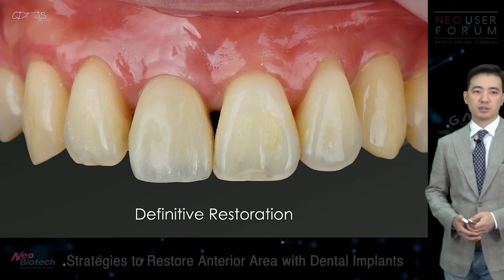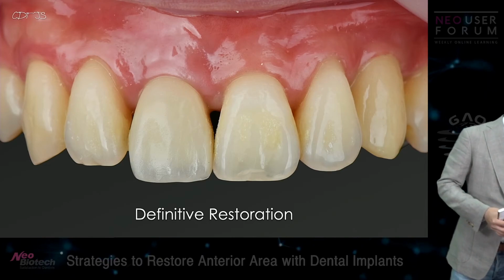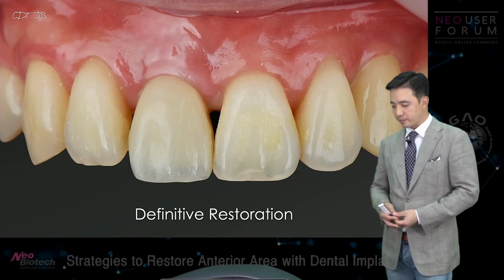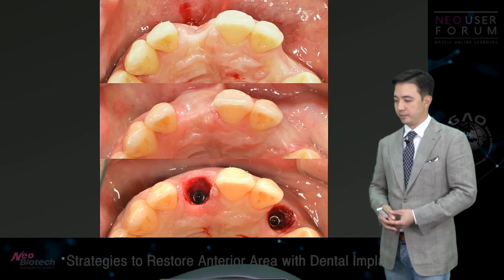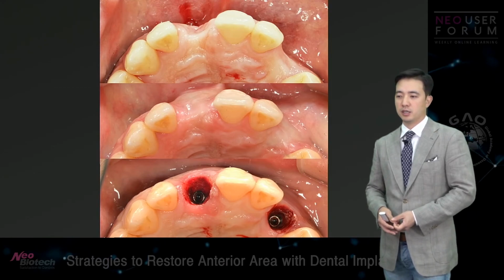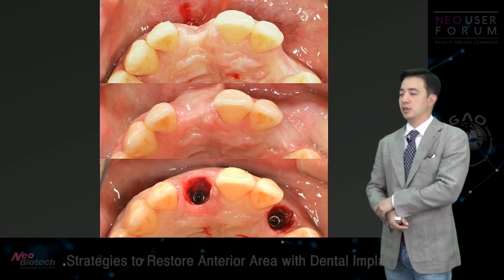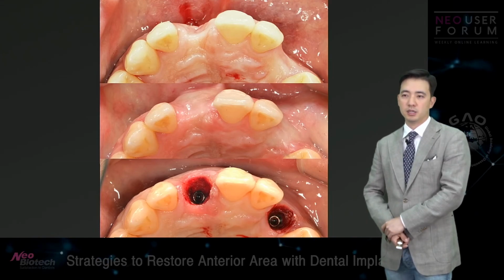Okay, so Dr. Christopher Sam asked me another question. Long-term roots left buccally. So I think he was trying to ask me what the long-term prognosis is when using the socket shield technique, okay? Well, honestly, it's been only 3 years for me to use that technique. So I can just tell you about my own experience.